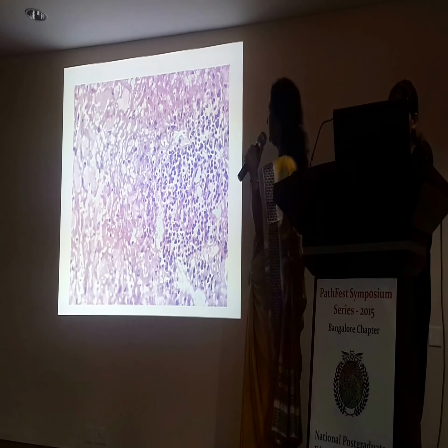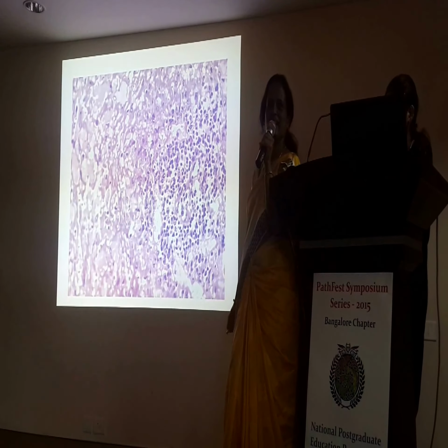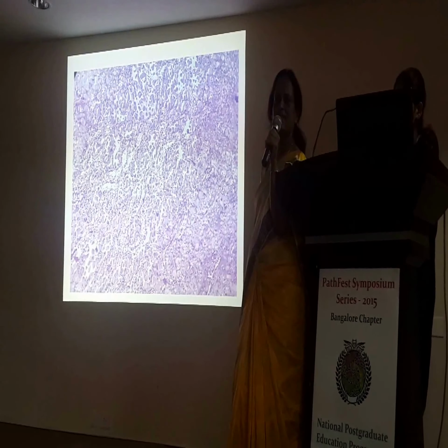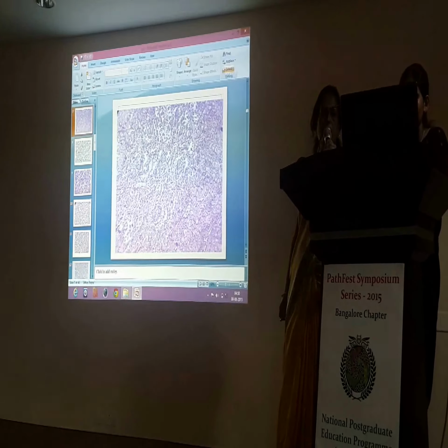Next. This is clear? What do you find here in this lymphoid aggregate? Arteriole, right? That is the one which tells you it is spleen. Yes, next. We'll go back to the images. You saw that architecture? What was that architecture you saw? Alveolar?